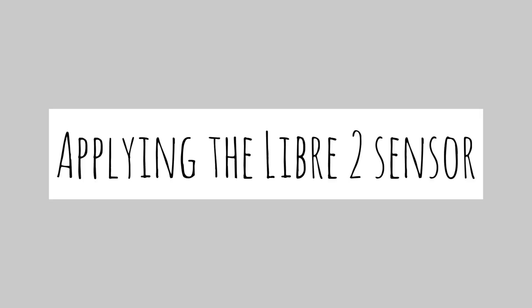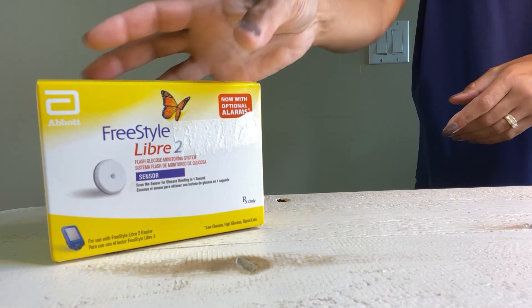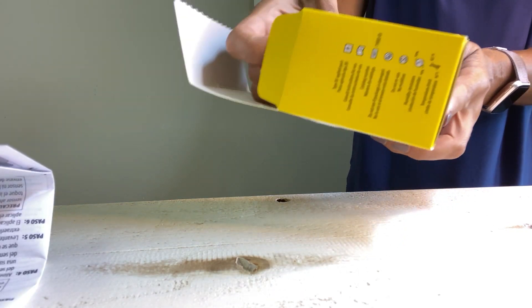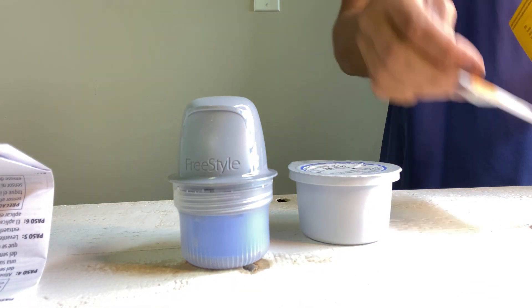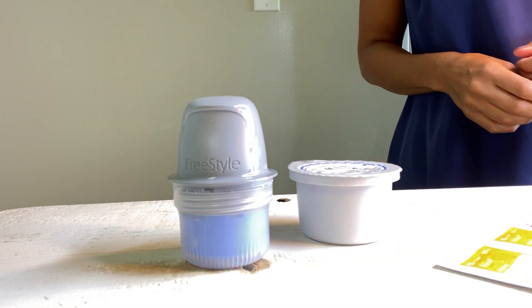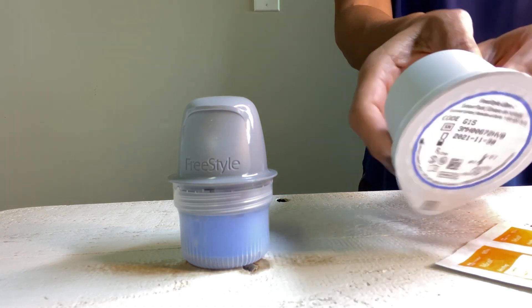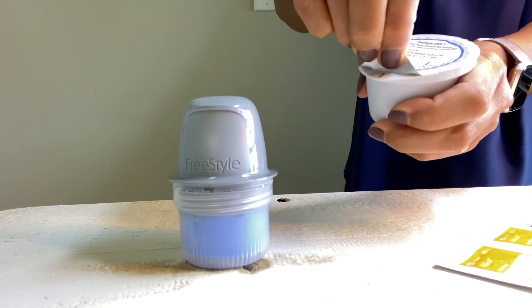Now let's get the sensor ready. It comes in a pack, so you simply take it out. There are instructions and all that good stuff included. It also comes with alcohol swabs. So these are the components. First, you want to peel the lid off the sensor pack — it even says 'sensor pack' right on it. Pull it off.